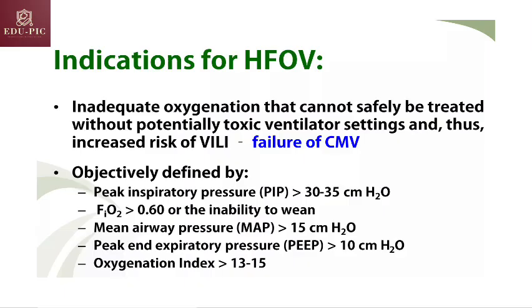So what are the indications for high frequency oscillatory ventilation? First of all, inadequate oxygenation that cannot safely be treated without potentially toxic ventilator settings, and thus increases the risk of ventilator-induced lung injury. Or you can say failure of conventional mechanical ventilation.